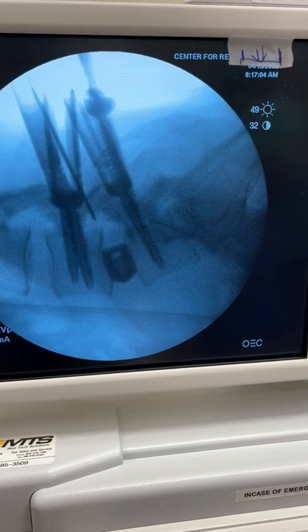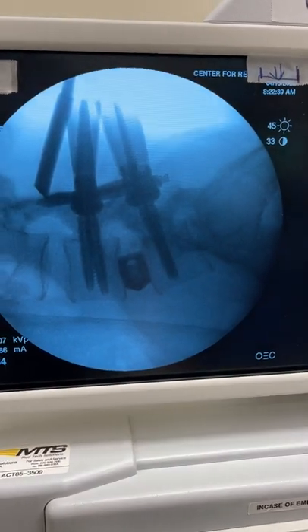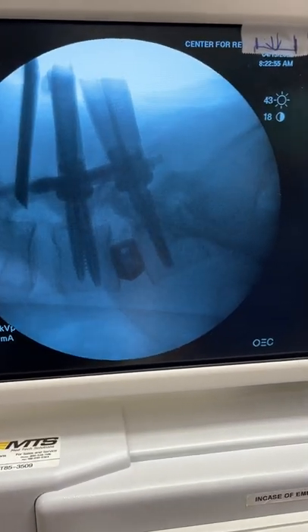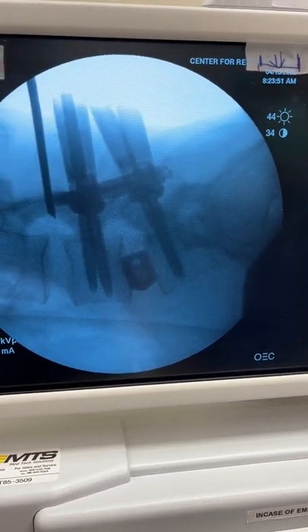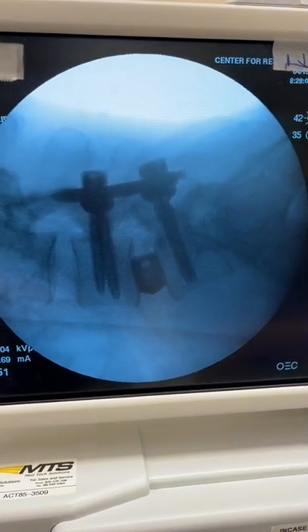One of the rods is a little too long, so we put a rasp and push the rod back. Then the rest of it is finishing the surgery — everything is locked, and this is our final picture. Thank you.